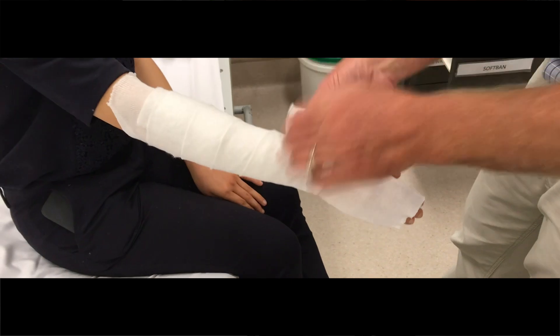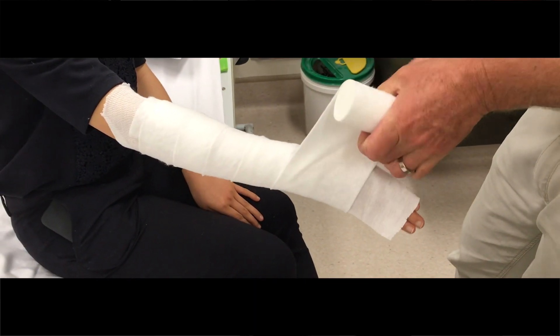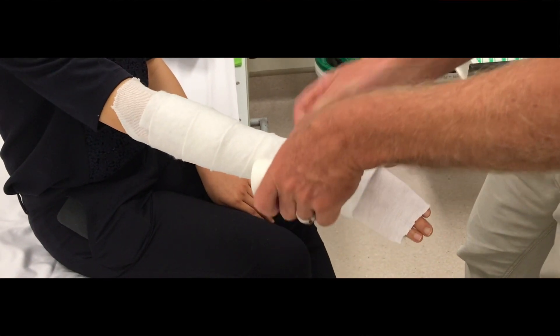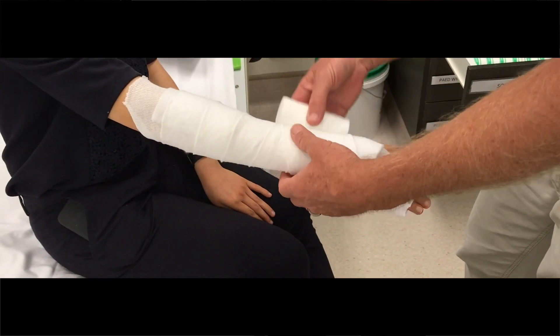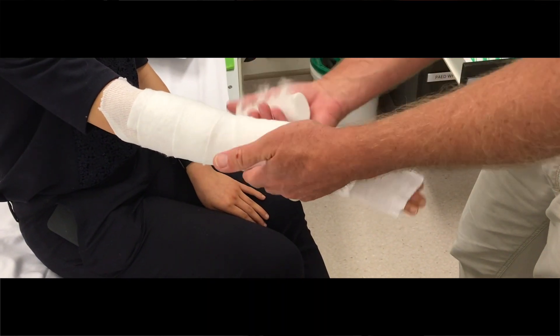When you get to the thumb, just pull that apart, make a little hole in it and put your thumb through it. And then where your fracture is, it's often good to do a double layer because that's where all the swelling is going to occur. And then that's your soft band.